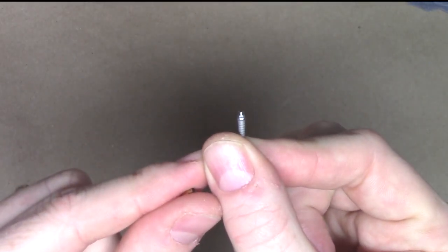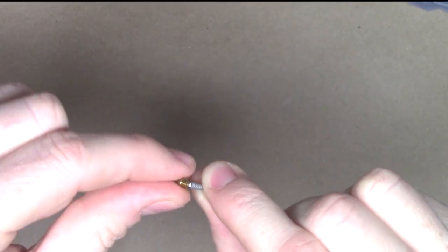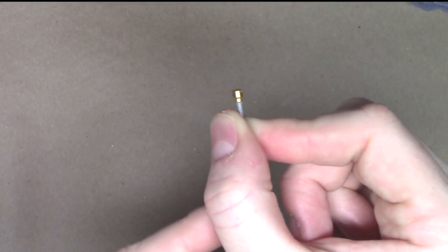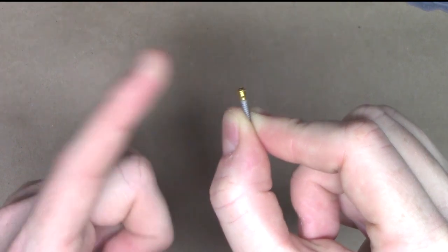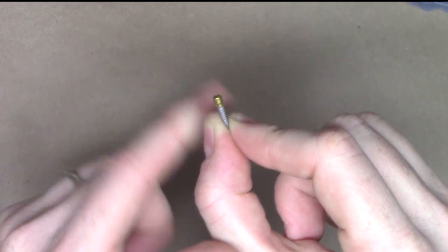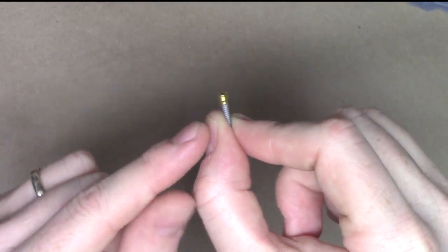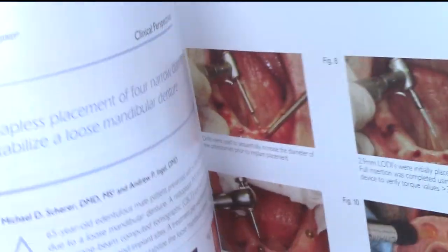A narrow diameter implant like the LOCATOR overdenture implant system typically is always unsubmerged healing, meaning a one-stage surgical protocol. Most clinicians are going to typically put this LOCATOR abutment on, and if you don't feel comfortable immediately loading this prosthesis, soft tissue reline or provide a relief space within the complete denture. So that is a major difference between the LODI implant, narrow diameter implant system, and a standard diameter implant overdenture system.